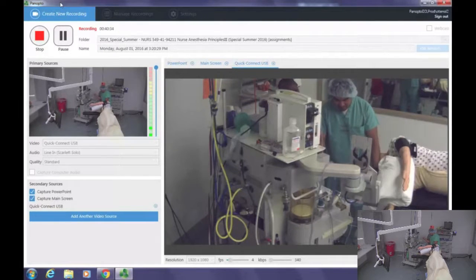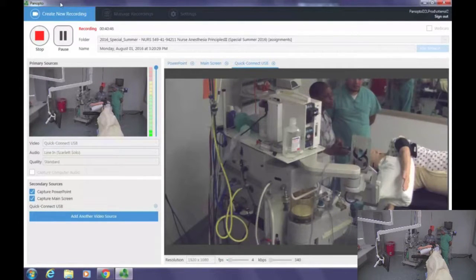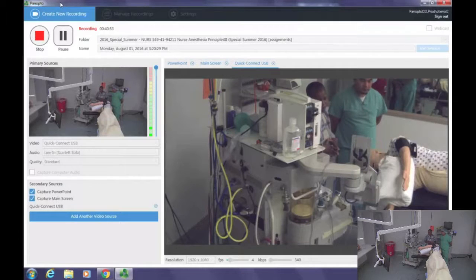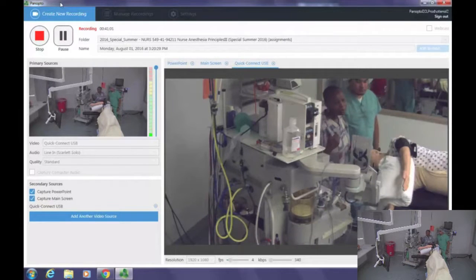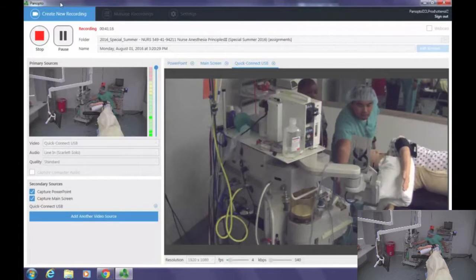Once the lung is dropped, we will change our ventilator settings from volume control to PCV, pressure control ventilation, so that we can maintain the pressures that we want. We're going to make sure that the PAPs stay below 35 and that our Pmax does not go beyond 40, which is a risk for barotrauma. We're going to increase the FiO2 to 100% oxygen, and maintain that for as long as the patient is under one lung ventilation.